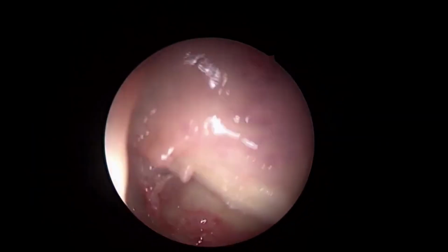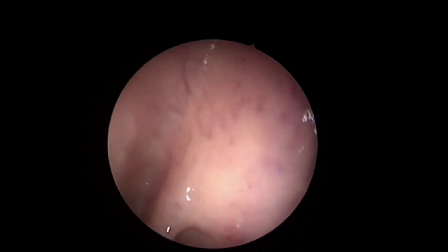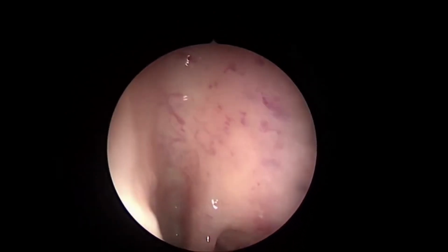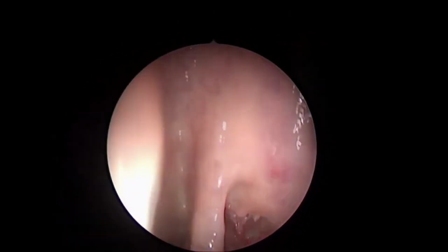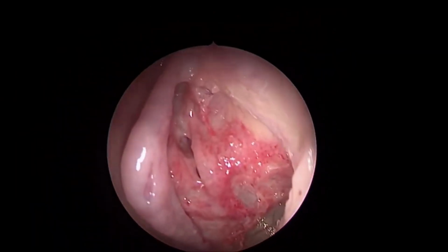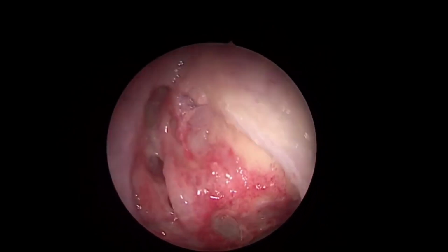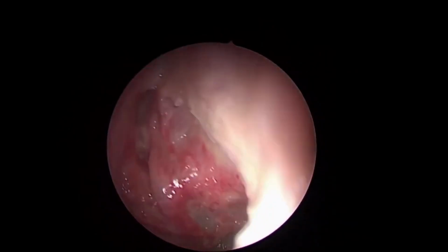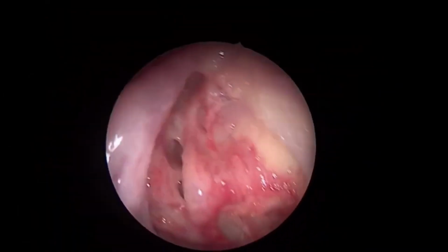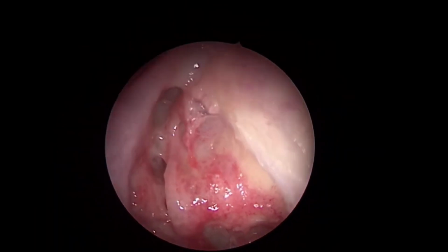If I want to work further in the interior part of the roof, I will make it more horizontal and make it even up to 120 degrees. See this? So this 70 degree is such a versatile telescope. With one telescope, you can do the entire surgery without changing the scope again and again. And for that matter, you need to get used to it. And here, the most important thing why I've changed to the 70 is to show something.